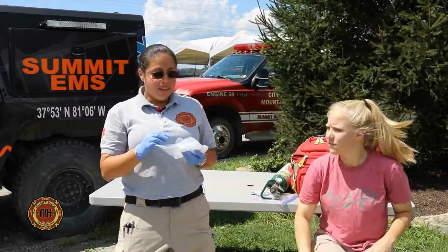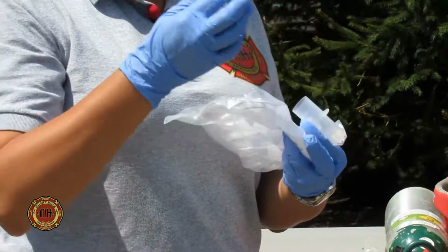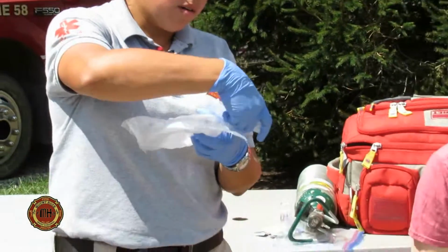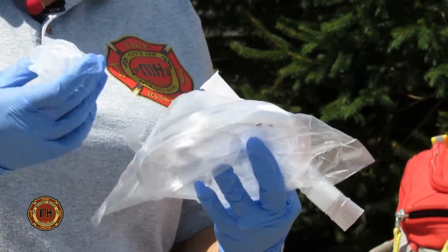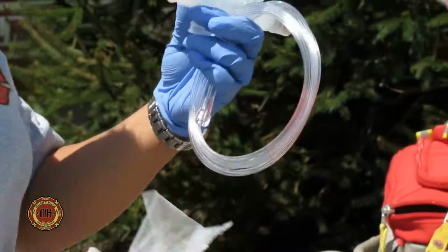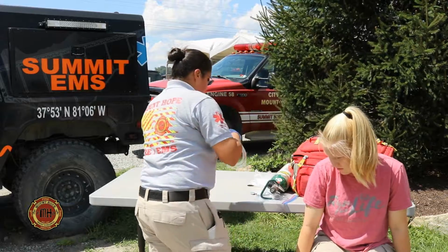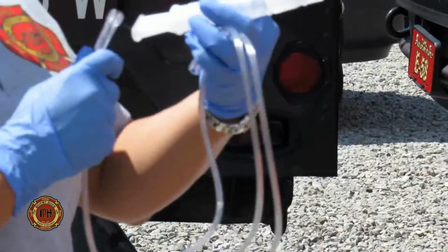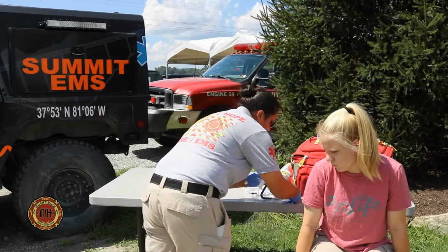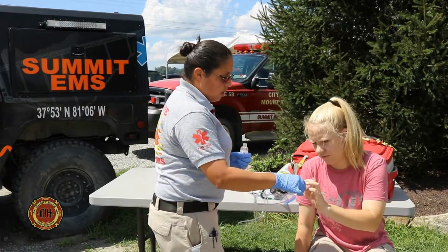We have our albuterol kit, and this is comprised of your mouthpiece, your tee piece, and this will connect your little plastic chamber, your nebulizer, and your oxygen tubing. So what we're going to do is we are going to connect our tubing to the bottom of the nebulizer and connect this side to our oxygen tank. We can have our patient hold this part or just hold it in our other hand.